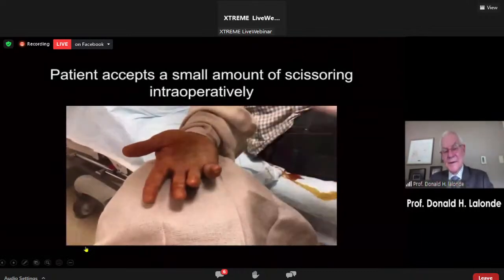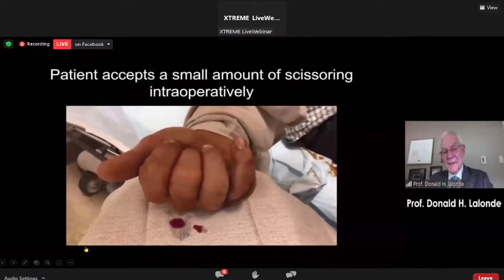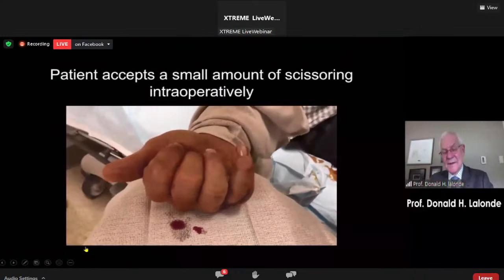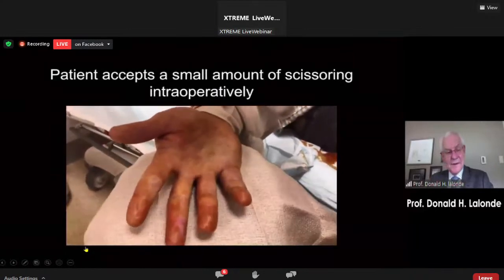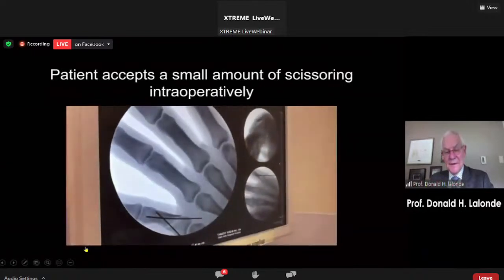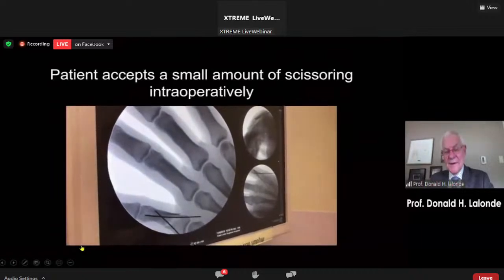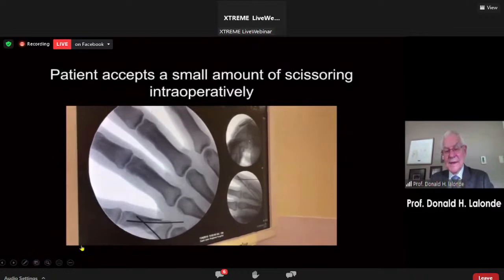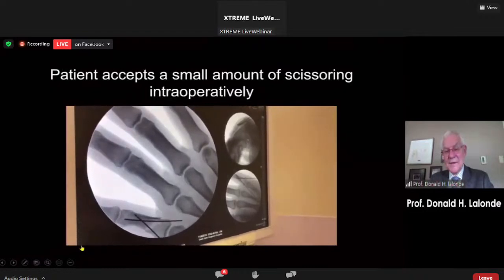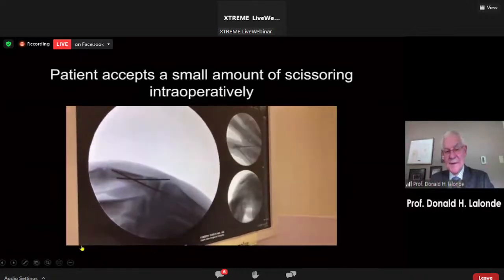And bring it in. And when you bring it in, look at that. Does that look crooked to you? That looks good. Okay, and straighten it out again. Beautiful. And we're just going to shoot the x-ray there and make sure that that's still good. Yep, it's not gone anywhere. And you can see why it's a little bit crooked, because it's not actually 100% perfect, but it doesn't have to be. It just has to be very close. Because like you said, you can live with it. It's like if something is just a little bit off, you can live with that. Does that make sense to you? Oh, yeah. Okay, great.